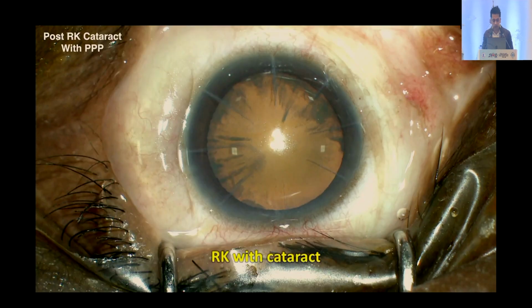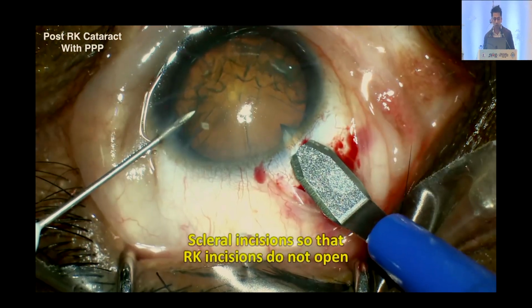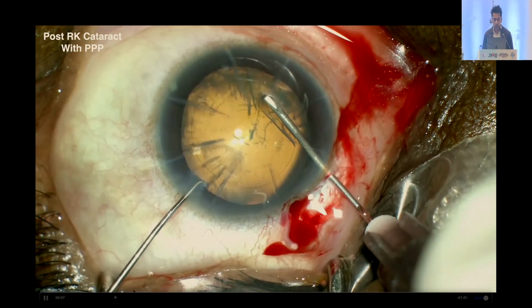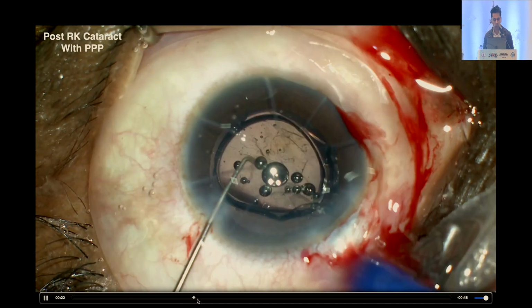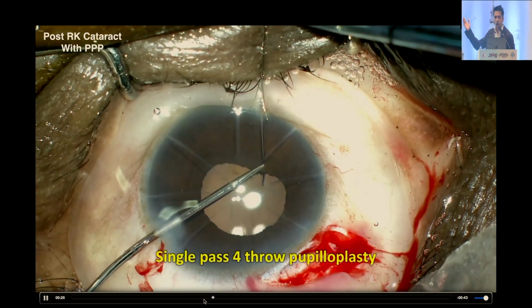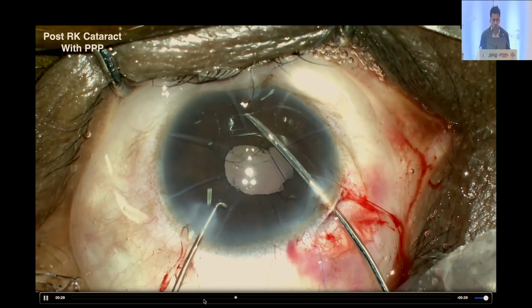Now, if this patient came to you a little bit dilated at this stage, they will not be happy. So I'm showing you the surgical procedure here, and because of time, I'm going to do away with the lens extraction and the IOL placement. All that goes as per normal except for the incision. Of course, in RK you have to be a little careful with the incision size and placement.